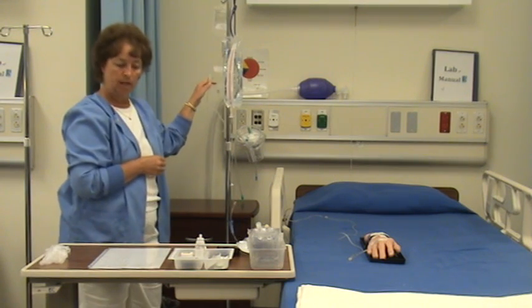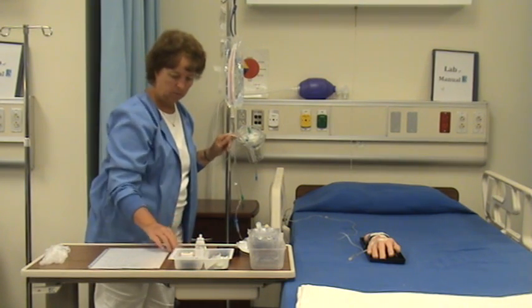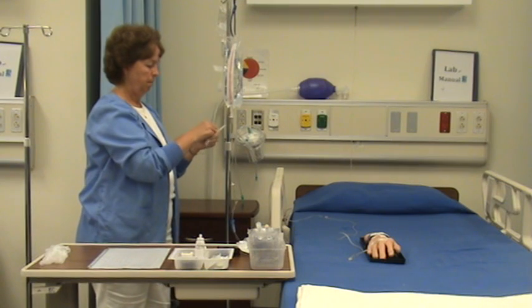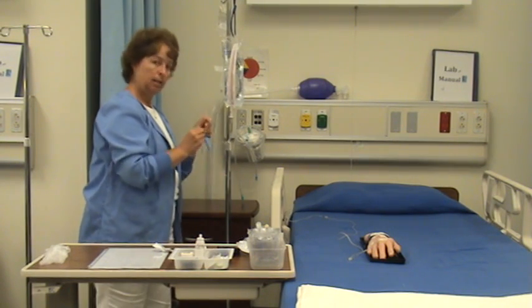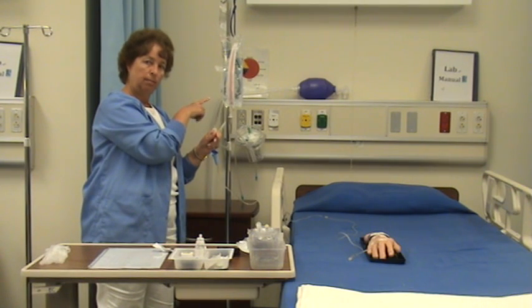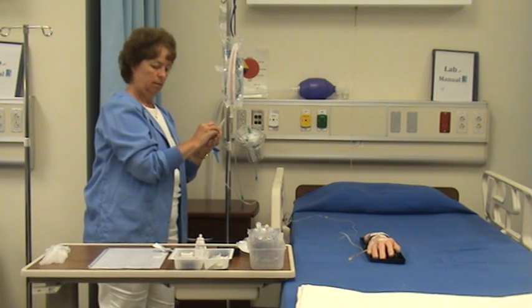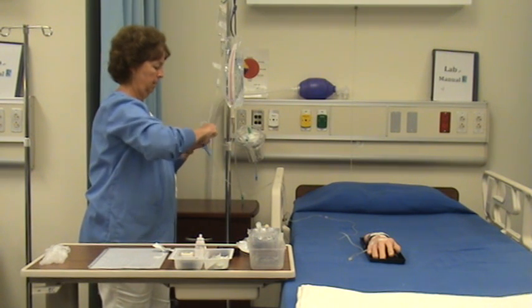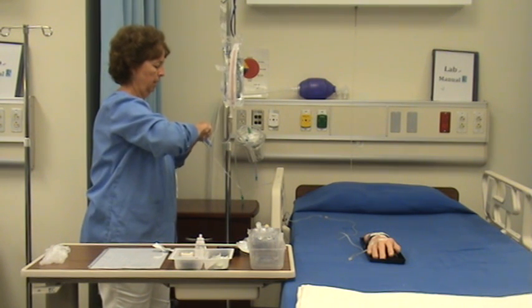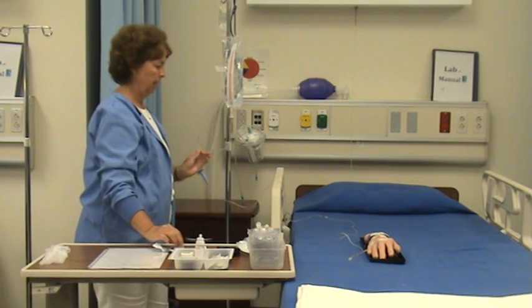Still got that closed off. I'm going to take an alcohol swab, clean the port closest to the primary IV bag, remove my cap, and plug in the secondary medication.